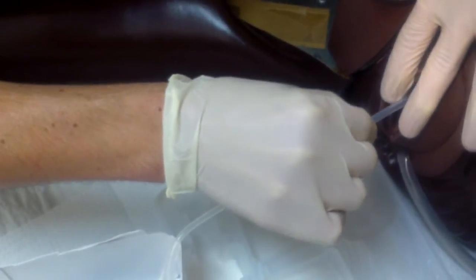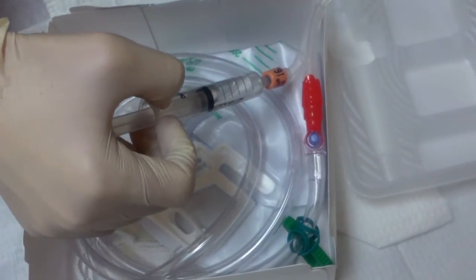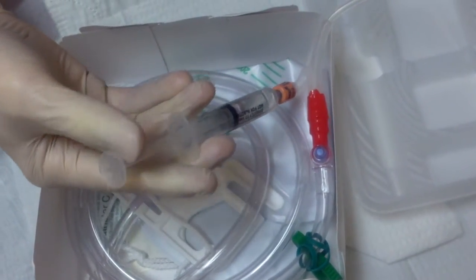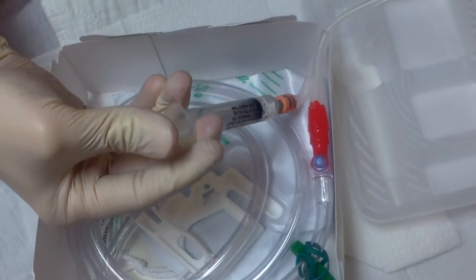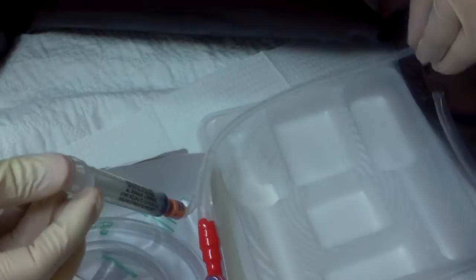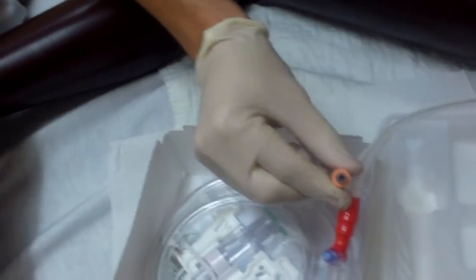After that, I'm going to kind of stabilize it. With my still sterile hand, I'm going to inject the amount into the balloon, and I would also note if there's any pain for my patient. I would stop immediately, and then I would advance the catheter another inch at least to make sure it is in the bladder. So then once the balloon is inserted, I will do a gentle tug, and notice that it is inserted there properly. So then I need to remove my thing. I'm going to touch the barrel, unclamp this, dispose of that, and then it is properly inserted.